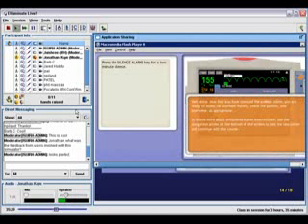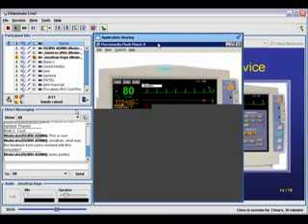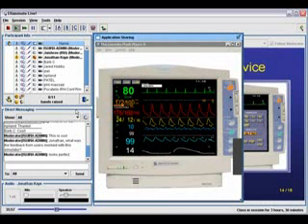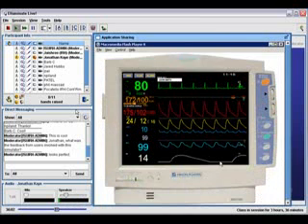Now, what you can do with the simulation, by building simulations, here you see the bedside monitor inside this little frame. But doing it in the right way, I'm going to show you what the actual simulator looks like. The actual simulator is built out separately. And then essentially the lesson configures which options are relevant.